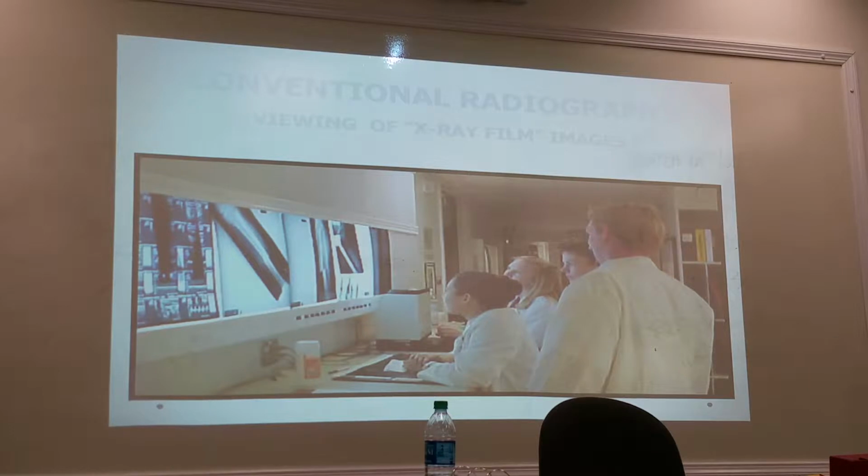Do you know what light does? As it goes any distance, it diverges, it spreads, and that decreases detail. So I showed you, did you see this? Did anybody care to look at that? Did you see that cardboard? Was that not exquisite? Okay, but the price is too high. The price is too high as far as exposure goes. So that's what the screens did.